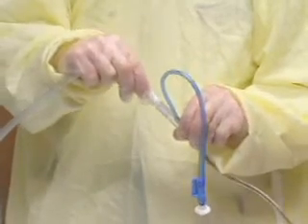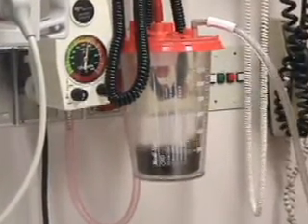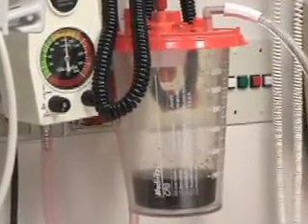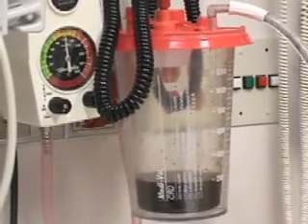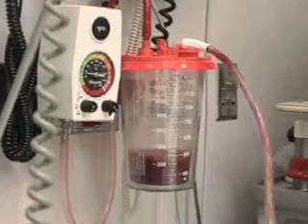NG tubes are often placed in patients with suspected upper GI hemorrhage. However, the sensitivity and negative predictive value of nasogastric aspirates for detecting active bleeding is suboptimal, and the absence of bloody return cannot be relied upon to rule out hemorrhage. Nonetheless, nasogastric intubation may be useful in selected patients. Evacuation of blood and clots from the stomach may facilitate endoscopic visualization of the gastric and duodenal mucosa, and the return of bright red blood does provide prognostic information.